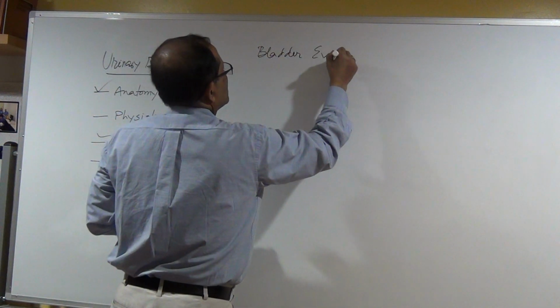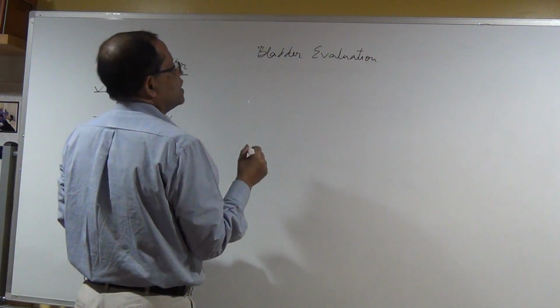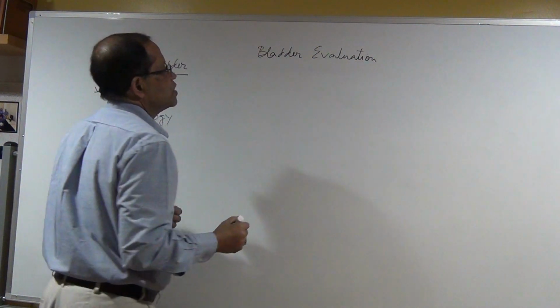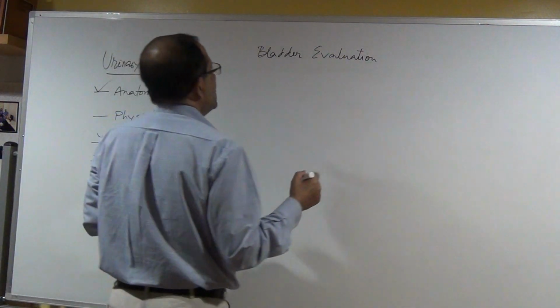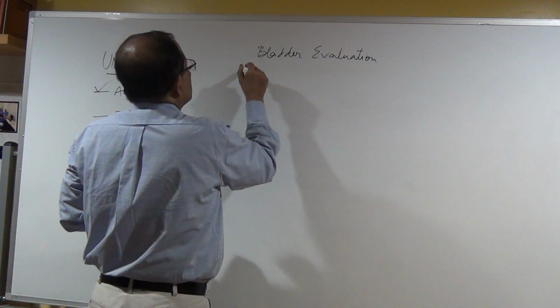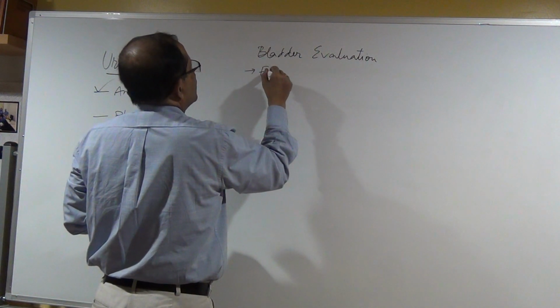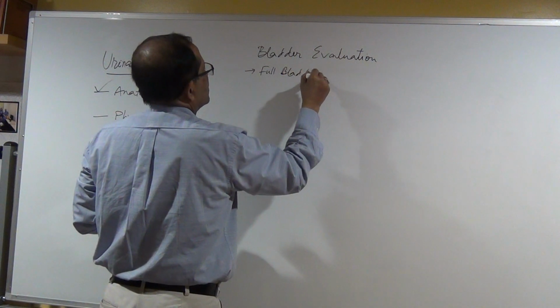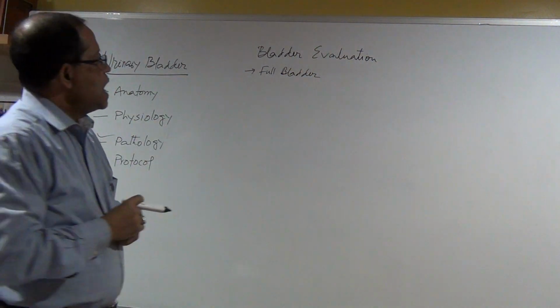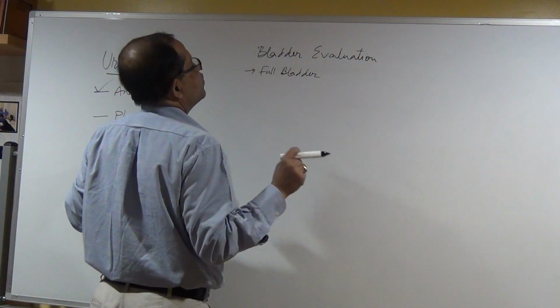Bladder evaluation. In bladder evaluation, we have to understand that the bladder must be full. We need a full bladder, right? And this full bladder, we need to check that full bladder.